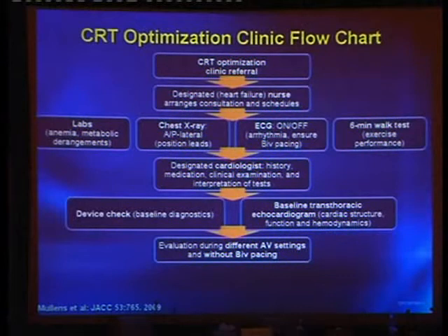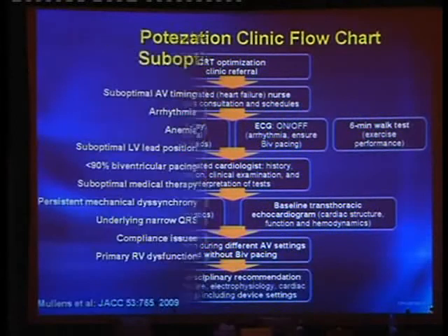I talk a lot, if I talk about pacemaker electrocardiography or radiography or anything else, that you've got to have a systematic approach. And after looking carefully at this article, I decided that my approach for CRT non-responders was not as systematic as it needed to be, because they've really done a beautiful job in the way they approach these patients.